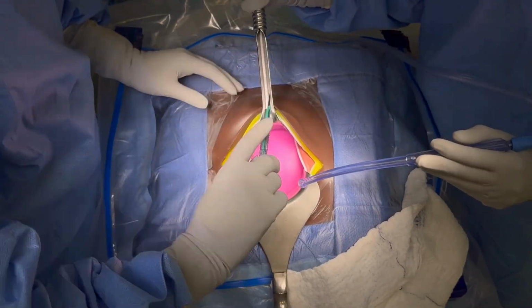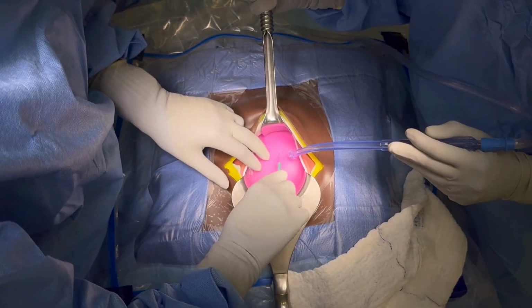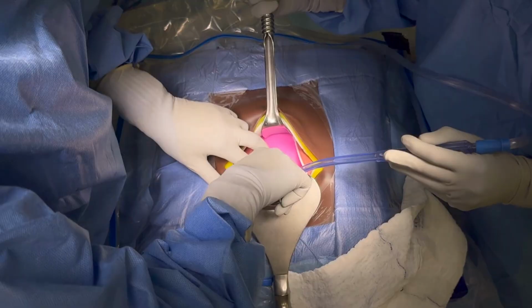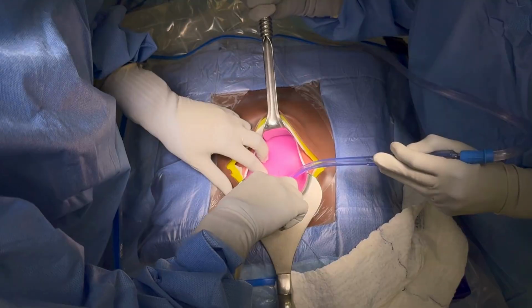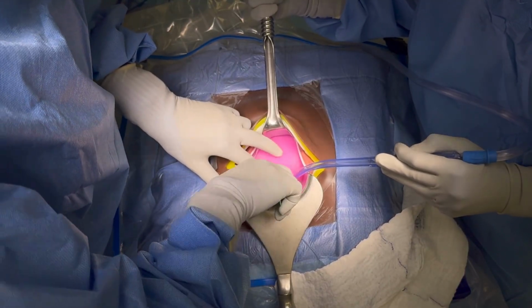A scalpel is then used to create a vertical midline incision in the anterior wall of the uterus, taking great care to avoid injury to the fetus. Although not pictured here, Allis clamps may be used to grasp the myometrium on either side of the hysterotomy and elevate it away from the amniotic sac while making the hysterotomy to avoid incidental amniotomy.